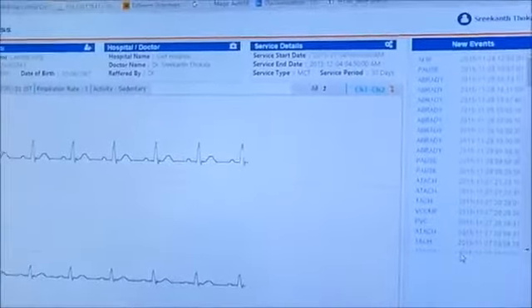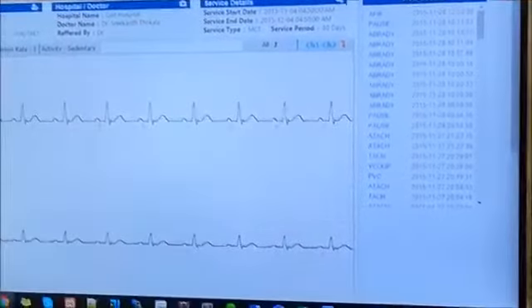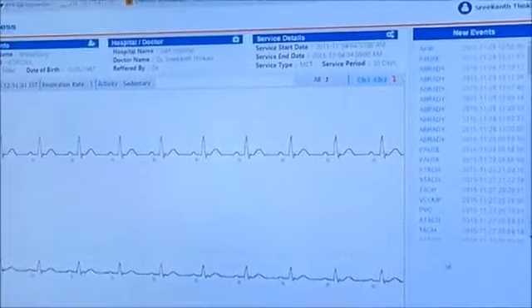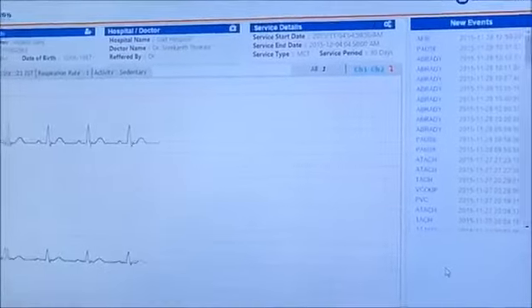We just wait for the data to load on the website. So you can see the device, and you can see the time here, which is 12:51, and you are getting the same time on the cloud. It's exactly the same time data that is getting displayed on the cloud.